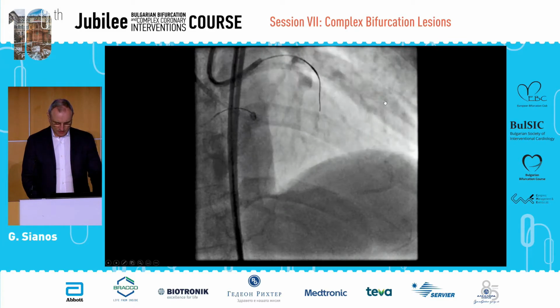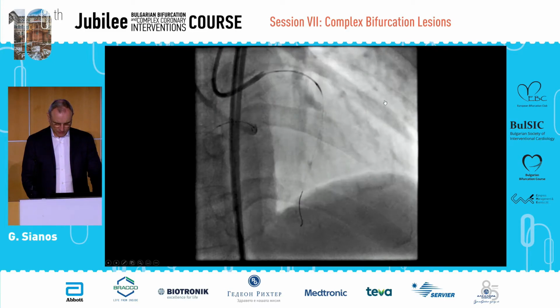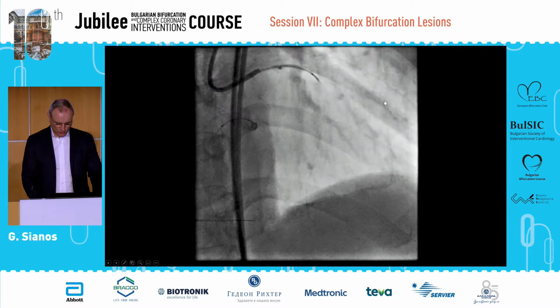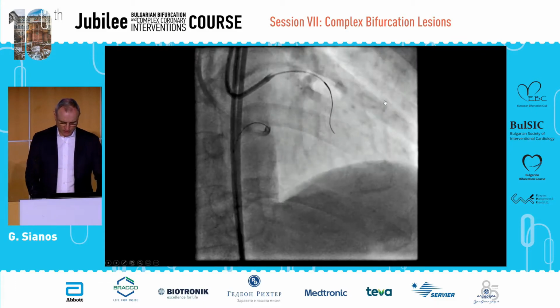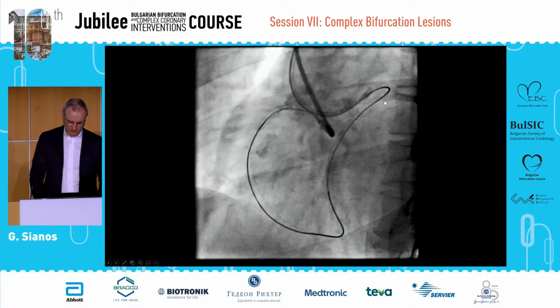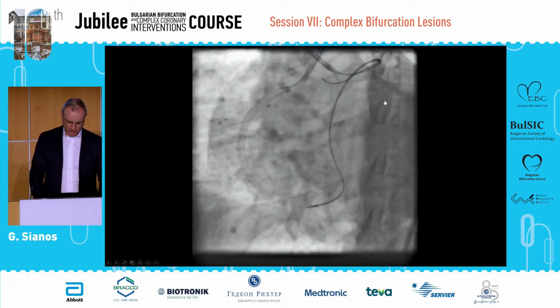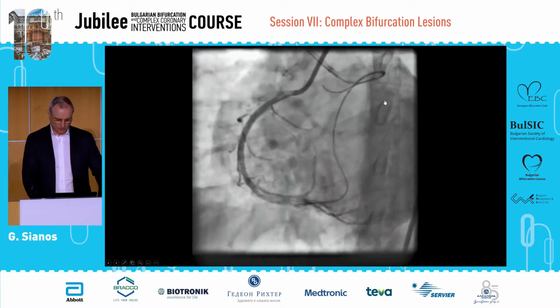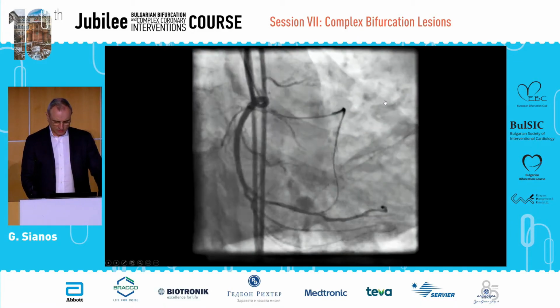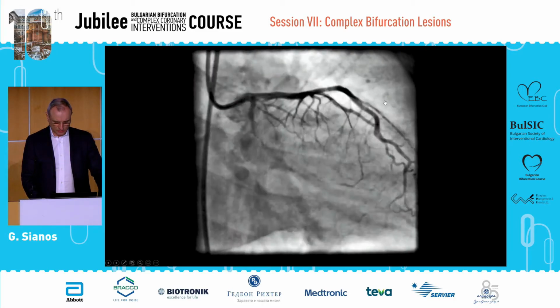Septal surfing retrograde access has been achieved for the right coronary artery. It was a blunt occlusion over there with the takeoff of a branch. The proximal cap was not clear. You can see here that retrograde crossing happened. The guide wire entered the antegrade microcatheter. Success was achieved in this case with the right coronary, and then we proceeded to the circumflex.